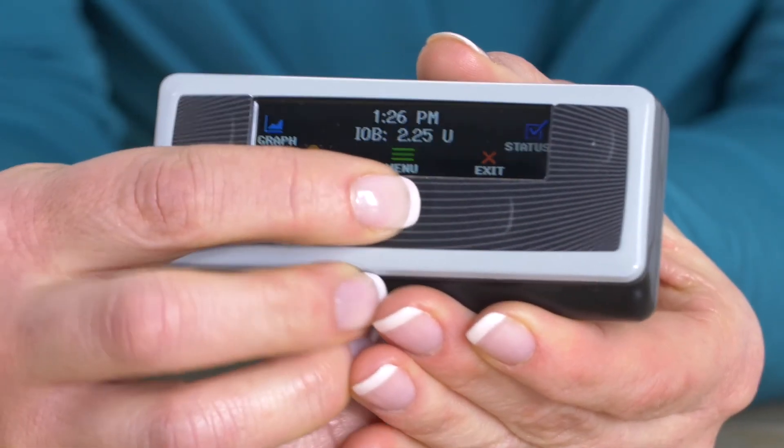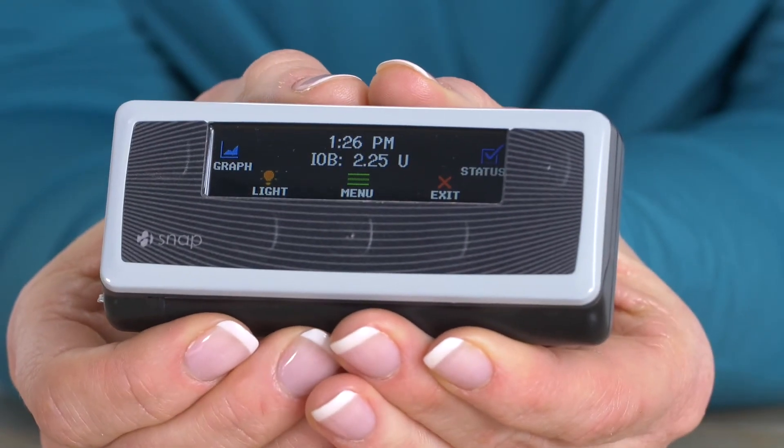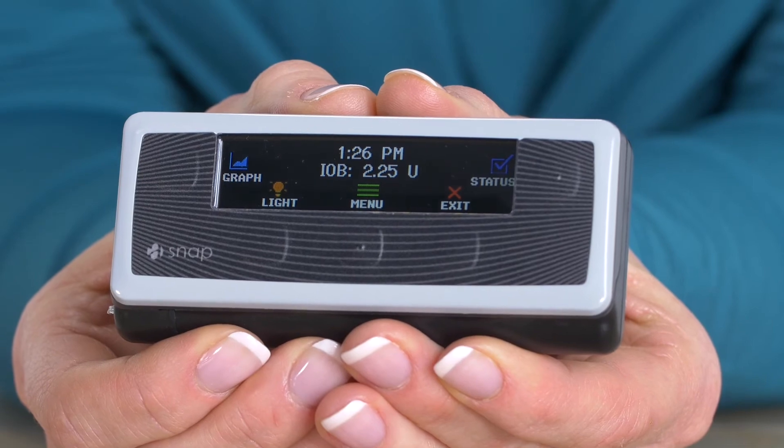Another helpful feature about SNAP is that it will tell you how much insulin is on board in your body, which means how much insulin is left over from the last bolus you gave. This information is on the home screen of the pump so it's always available to you.